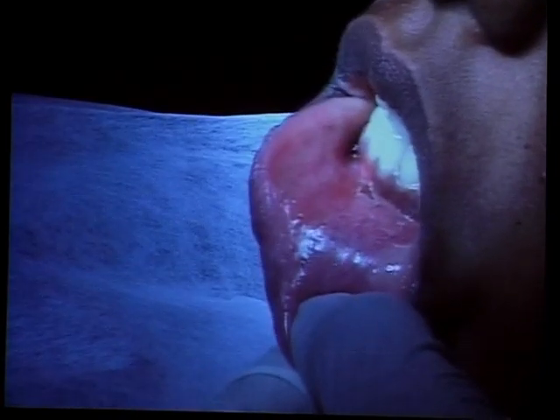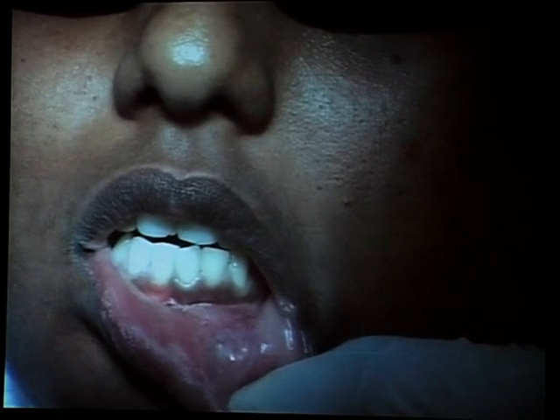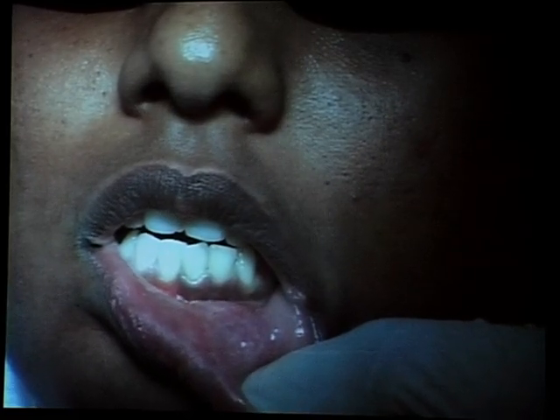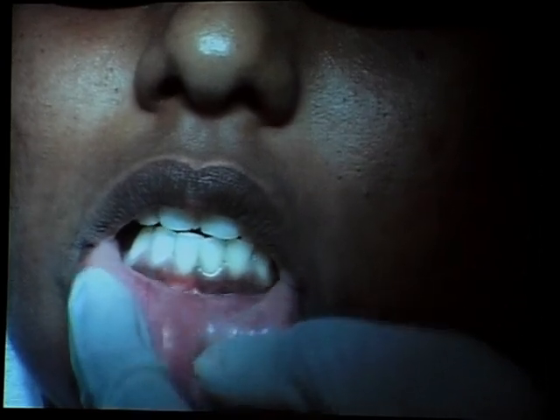Will that also work as a gated kind of mode, Ralf, the movement of the fiber? Also with gated mode. That doesn't depend on the mode of operation. You always have to move the fiber. Never stop on a point. Otherwise you will give too much thermal energy to that point. It will accumulate at that point. So always keep in motion, always. And that's for periodontic surgery in every case. Always keep the fiber in motion. Never stop at a point. And we've got great hemostasis. There's not even a drop, right? Yeah. That's the main advantage.